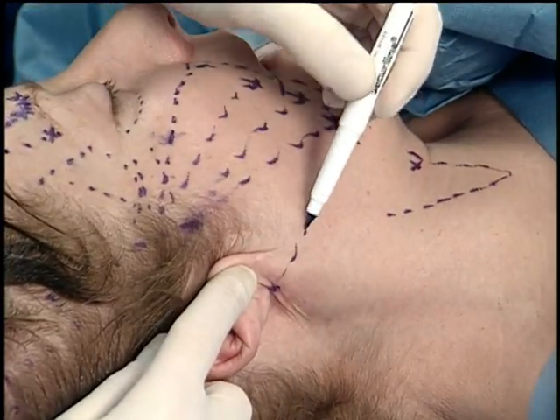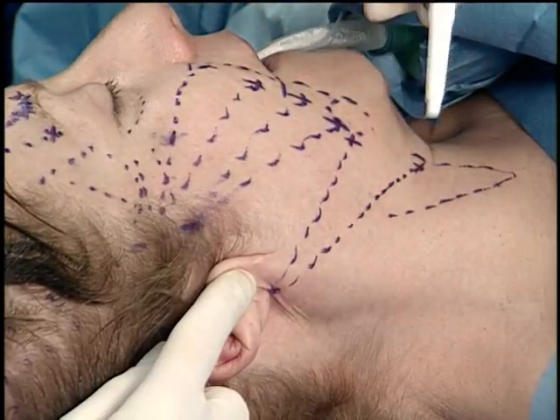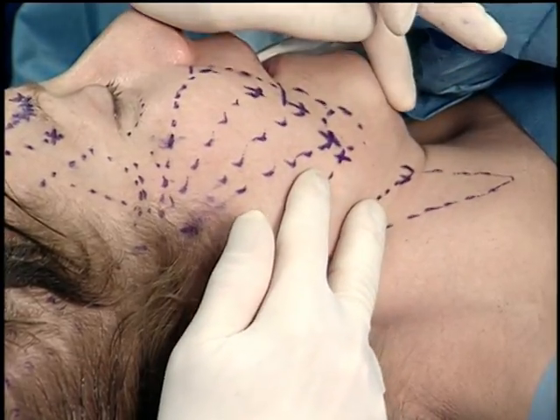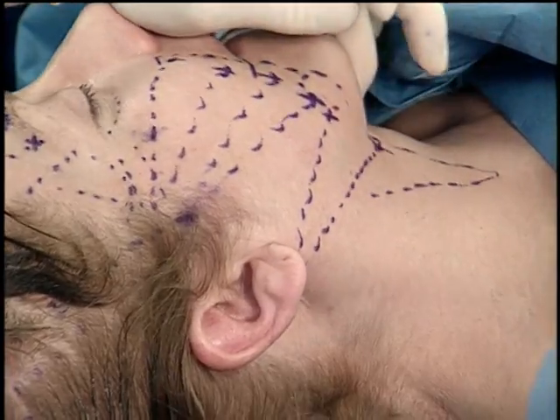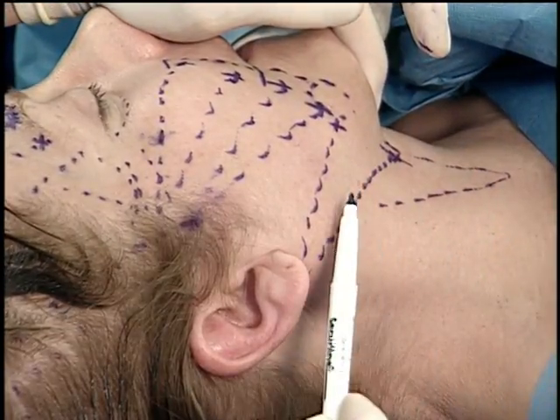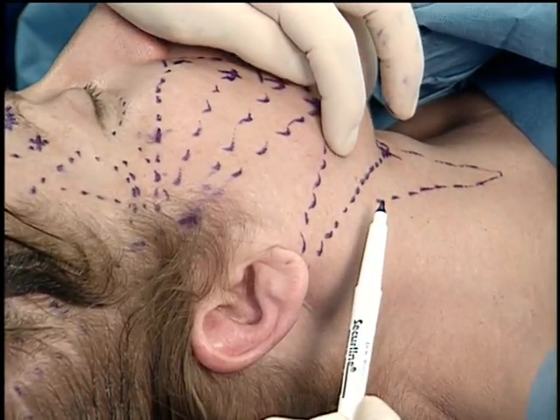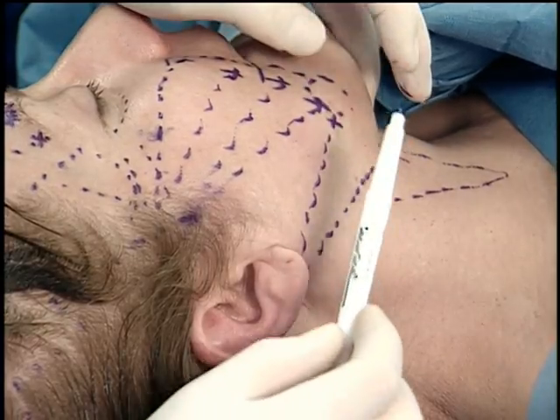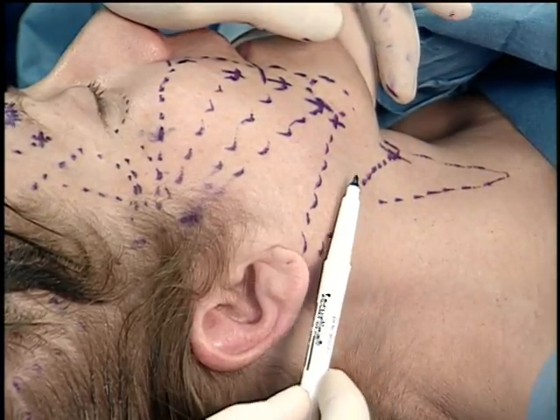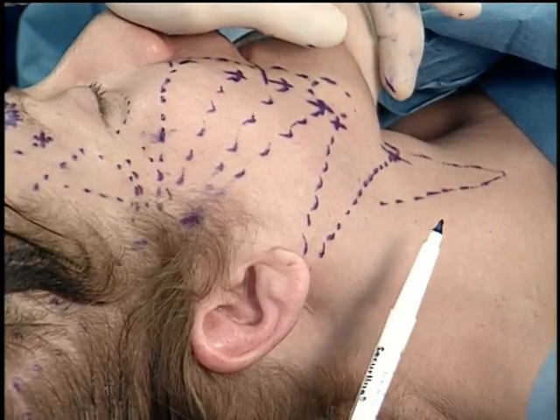So here is our deployment trajectory: 1 above and 1 below the mandible, to split and really define the jawline. Now, there's always much concern about the marginal mandibular branch of the facial nerve. Anywhere along this path, above or below, you can injure the marginal mandibular branch. 80% of the time it is above the mandible, above the facial artery, right there, 20% below. That's only if you're subplatysmal. If you stay in the subcutaneous space as you're supposed to, the marginal mandibular branch is never in danger.